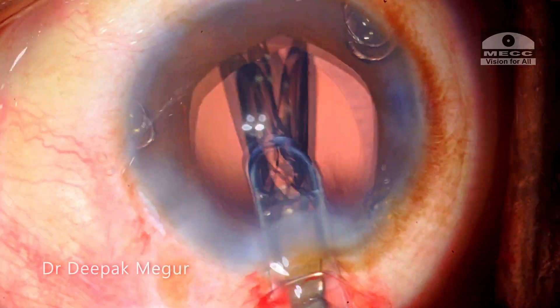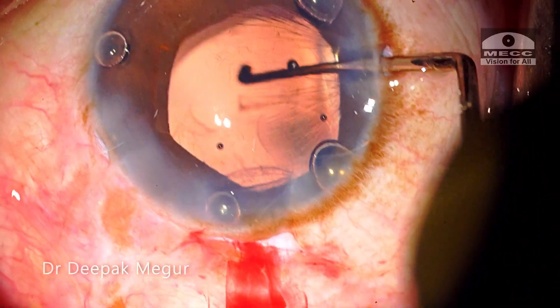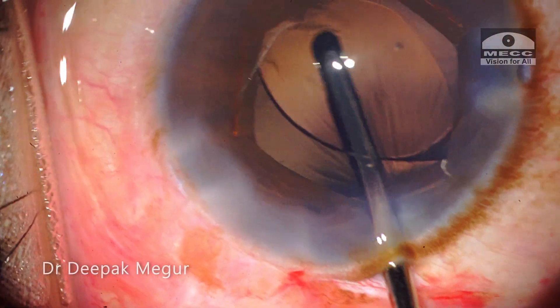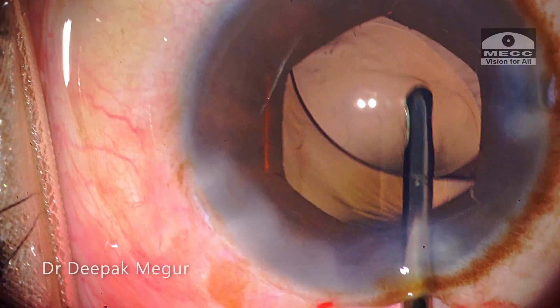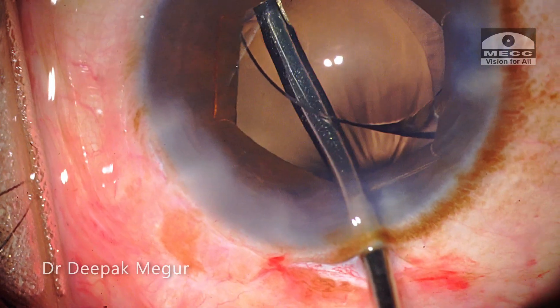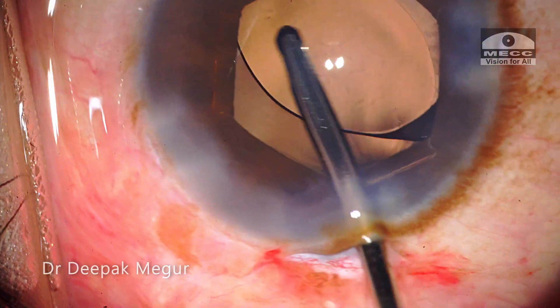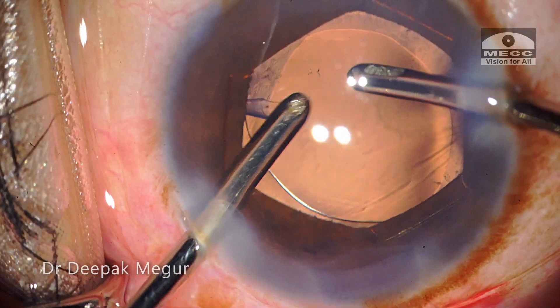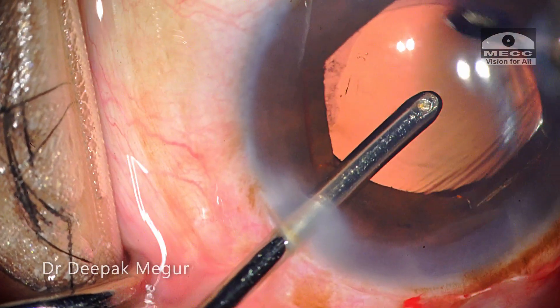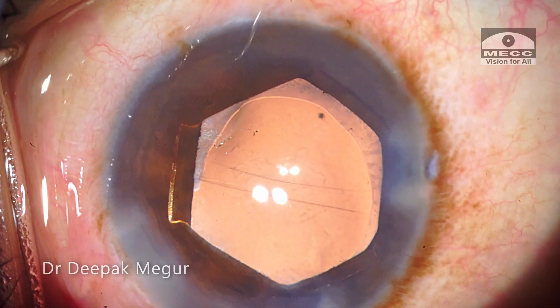A single-piece hydrophobic IOL is implanted into the bag. In a routine case, I would have removed the BX device at this stage. But because the rhexis has gone radial, I retain the ring until I remove all the OVD from behind the IOL and in the bag, and also confirm that the IOL is in the bag and the haptics are away from the area of the discontinuous rhexis.